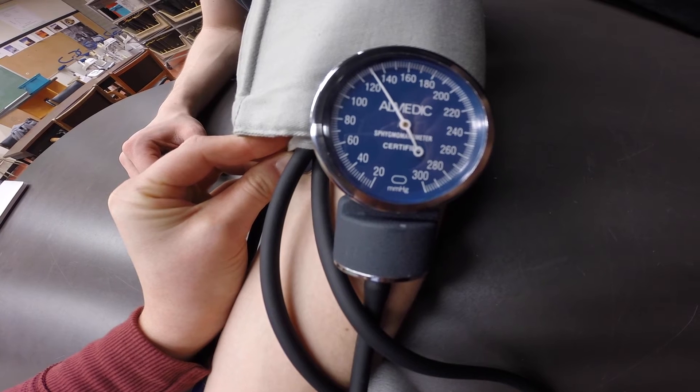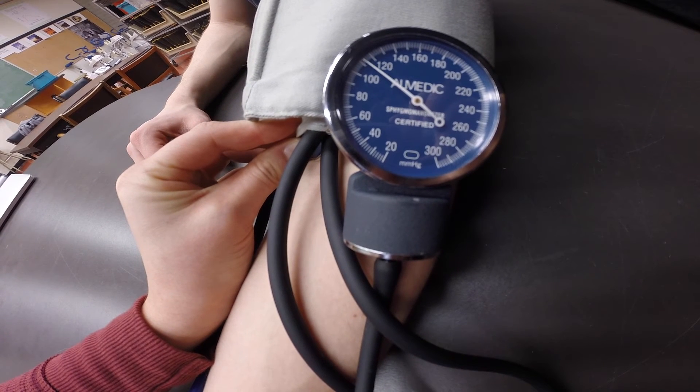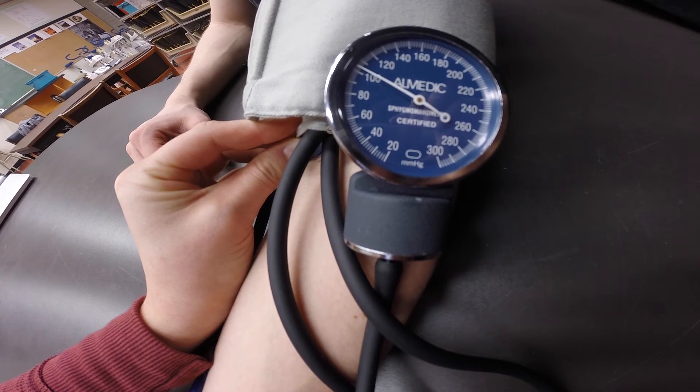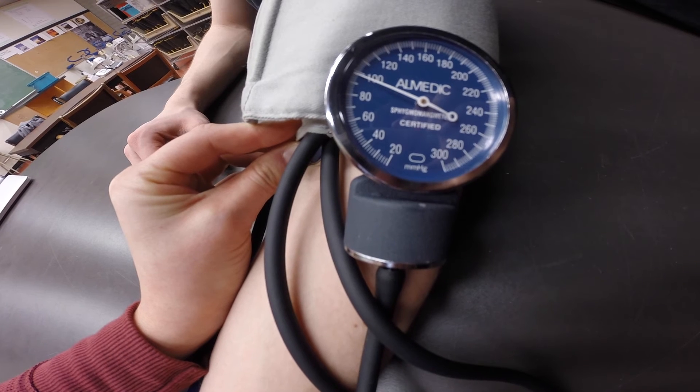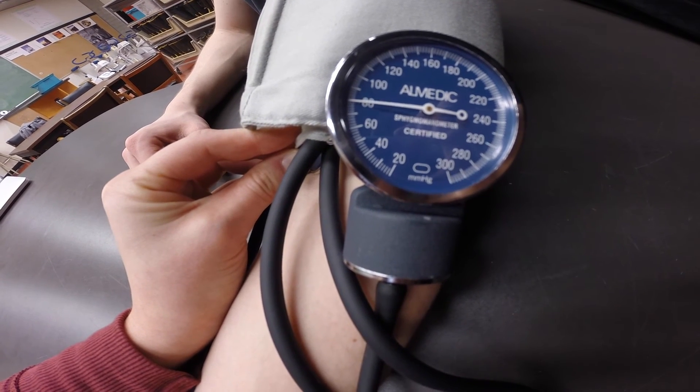Now listen for the first sound of beating. This is called the first Korotkoff sound and it identifies the systolic pressure. Keep letting air out at about 2 mmHg per second until the beating finally stops or is muffled. This is called the fourth Korotkoff sound and it identifies diastolic pressure.